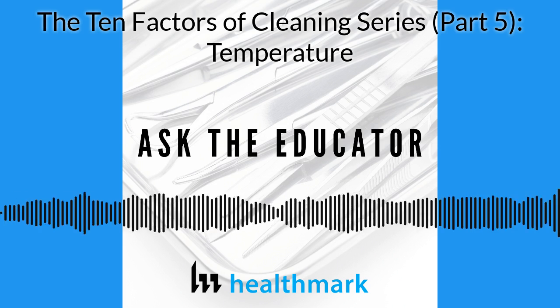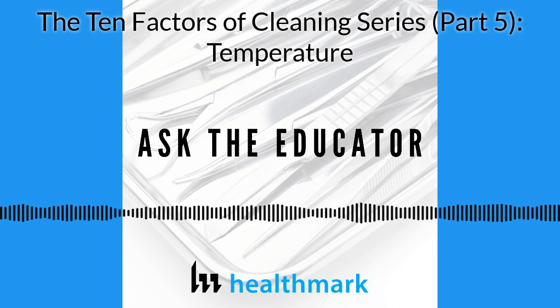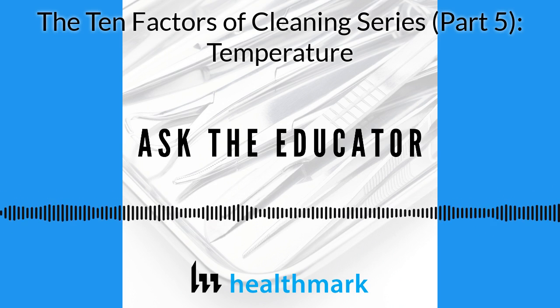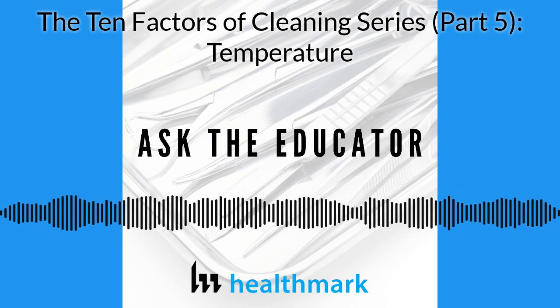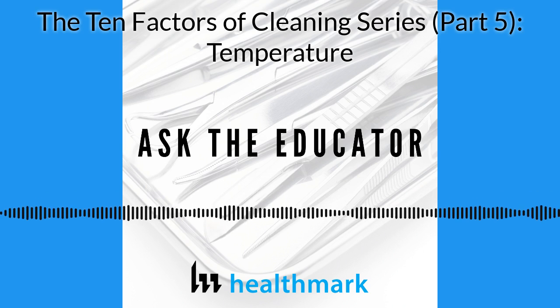There was no need to monitor the temperature necessarily in terms of the detergent working, like an optimal temp for the detergent. But you just touched on the very beginning of the process where you're just simply rinsing off the instruments, and how it needs to be. In fact, colder is a little bit better in a lot of ways. And that's something that's probably very basic, but at the same time, I know that I didn't know that. And I know that there are a lot of people out there that don't know that.